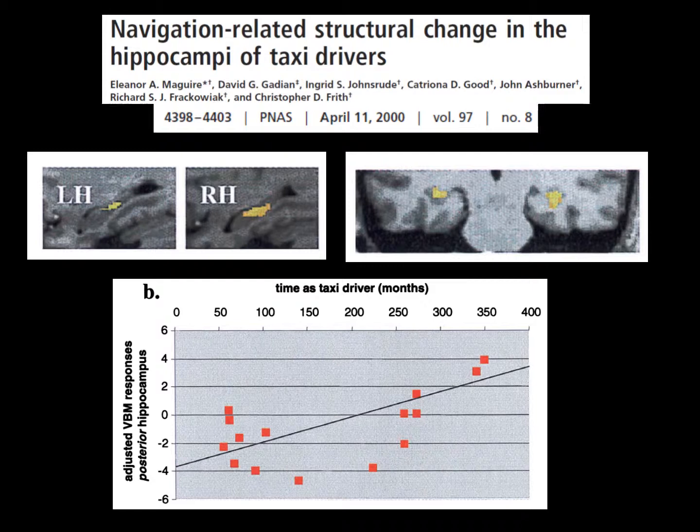Overall, voxel-based morphometry is a relatively simple, automated analysis procedure that can provide a relatively crude indication of brain regions in which a change in local anatomy has occurred. What precisely a reduction or increase in grey matter volume represents at a cellular level is open to interpretation. Increases could result from a range of changes such as dendritic sprouting, inflammation, glial activation, etc. What voxel-based morphometry does is give you a great starting point for further investigations, particularly in situations where there is very little prior information as to the neurobiology of a certain condition.